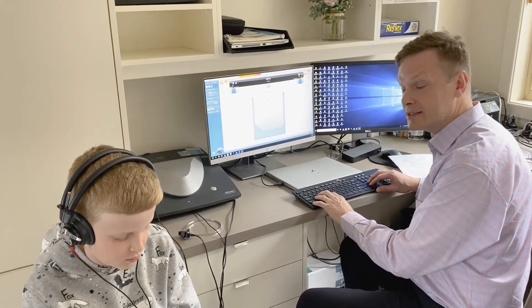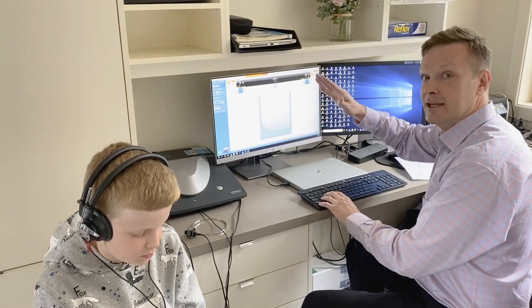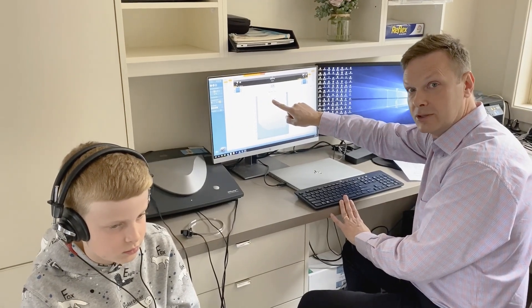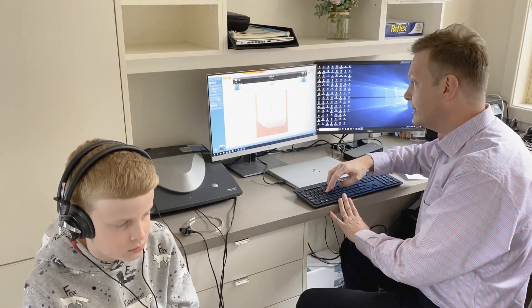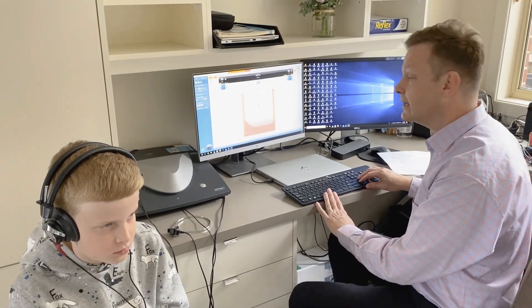He's heard it twice at 0 on the ascent, so we'd normally mark that. When doing the left ear it's a cross; when doing the right ear it's a circle. If I store that, you can see that's now a cross on the screen at 0. I'm going to go ahead and do the right side now — I want you to fill in the audiogram yourself as to where you think it should be. Starting at 30 dB again.